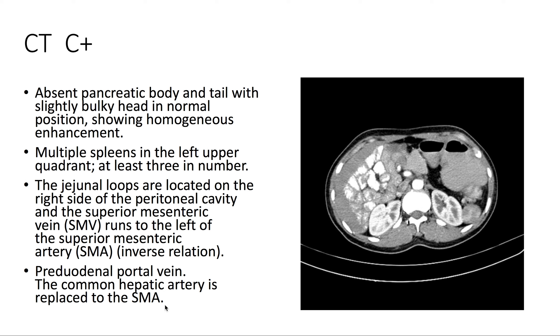On the CT with contrast, we see that there's an absent pancreatic body and tail with a slightly bulky head in normal position with homogeneous enhancement. There are also multiple spleens in the left upper quadrant, and we see that the jejunal loops are located on the right side of the peritoneal cavity.